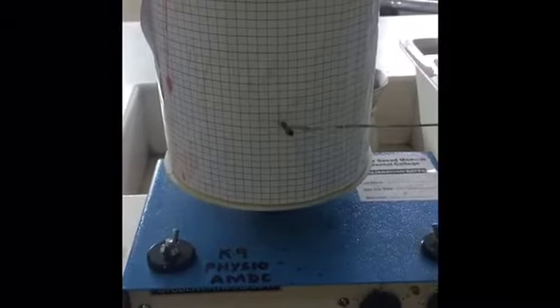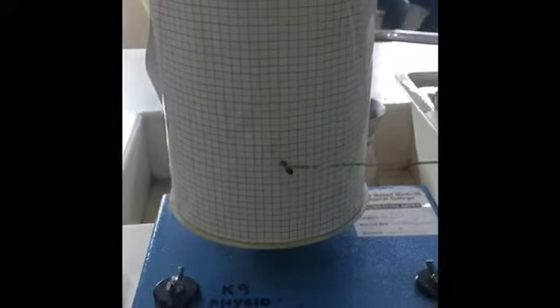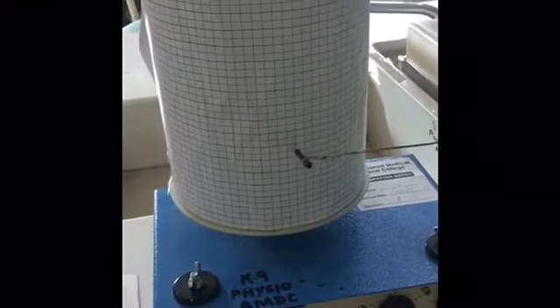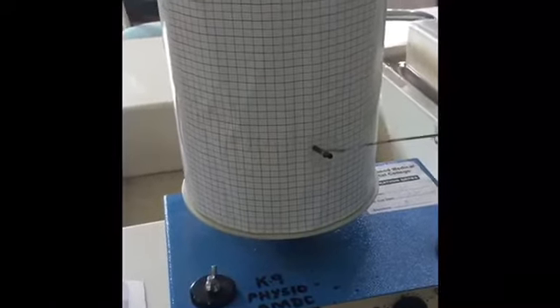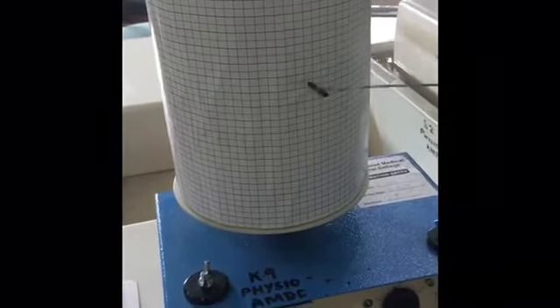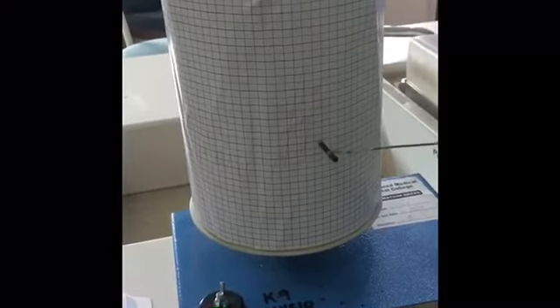Now you will instruct your subject to take a deep breath inside. This deep inhalation represents our inspiratory reserve volume. Now the subject will take normal breaths, then you will ask the subject to forcefully exhale. This forceful exhalation represents the expiratory reserve volume.